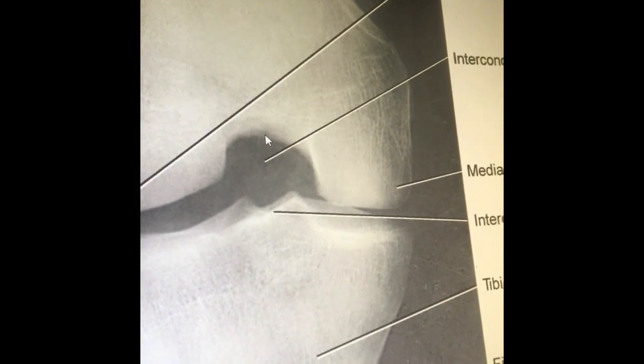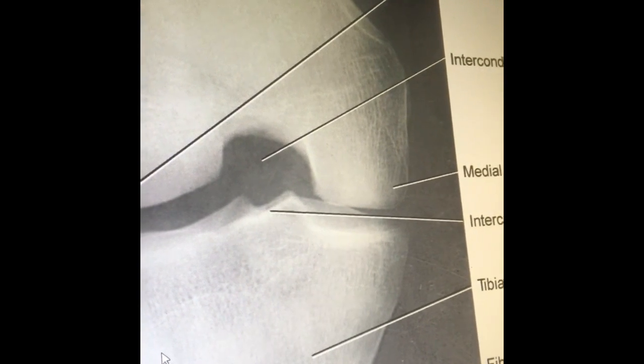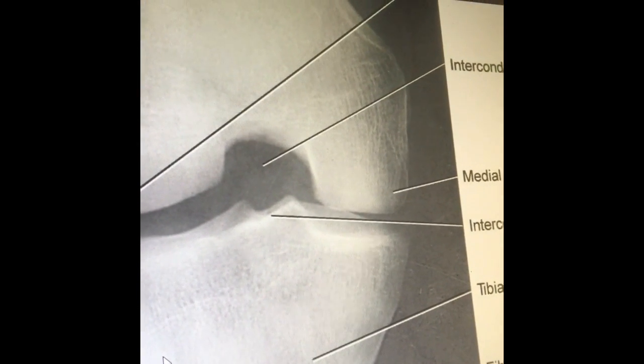So also no superimposition of the fossa by the apex of the patella, and we can see we're nice and clear here. And also making sure no rotation, which can be demonstrated by a slight tibiofibular overlap, once again, just like our AP knee. And also want to be on the lookout for soft tissue and bony trabecular detail. And since this projection was performed tabletop, our technique would be shifting to 70/5 ballpark range.